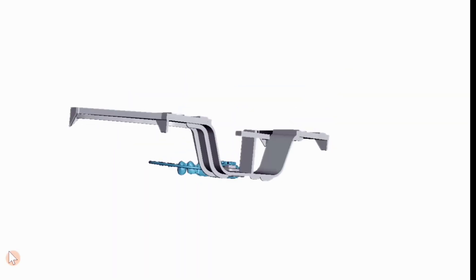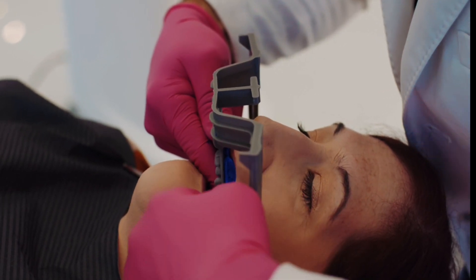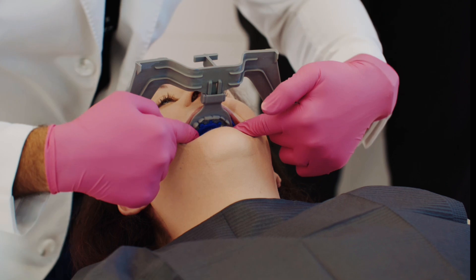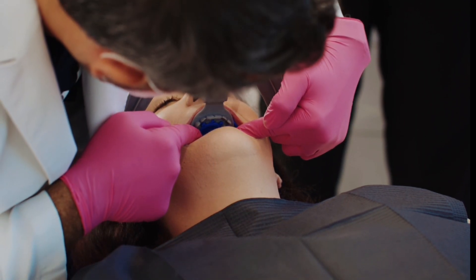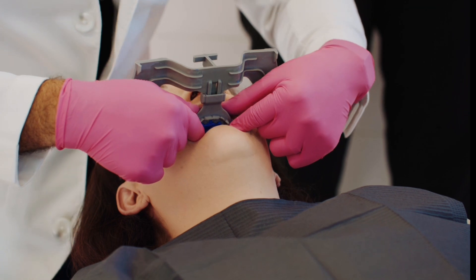And then from here, we need to capture the bite record. To do that, we're using the Mod Denture Record System. This is a free download from the Mod Institute website. You can 3D print a fox plane that snaps into a centric tray.